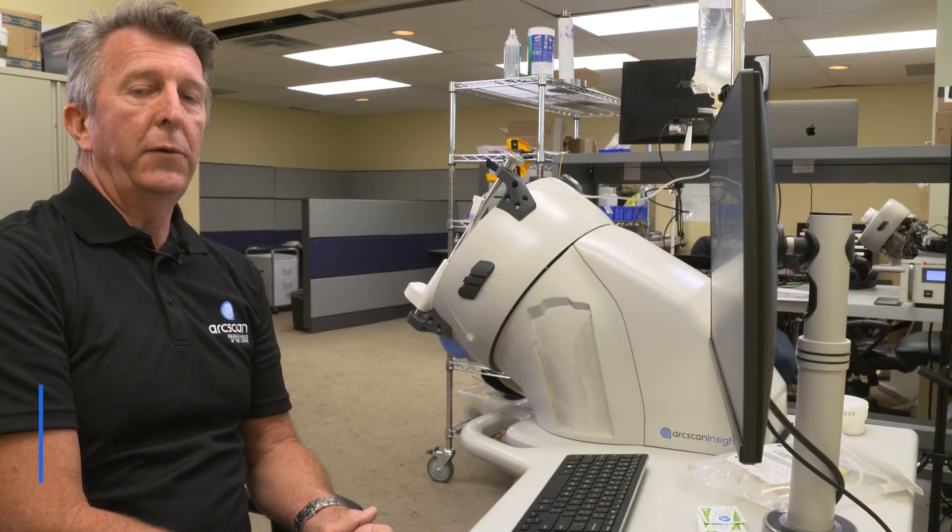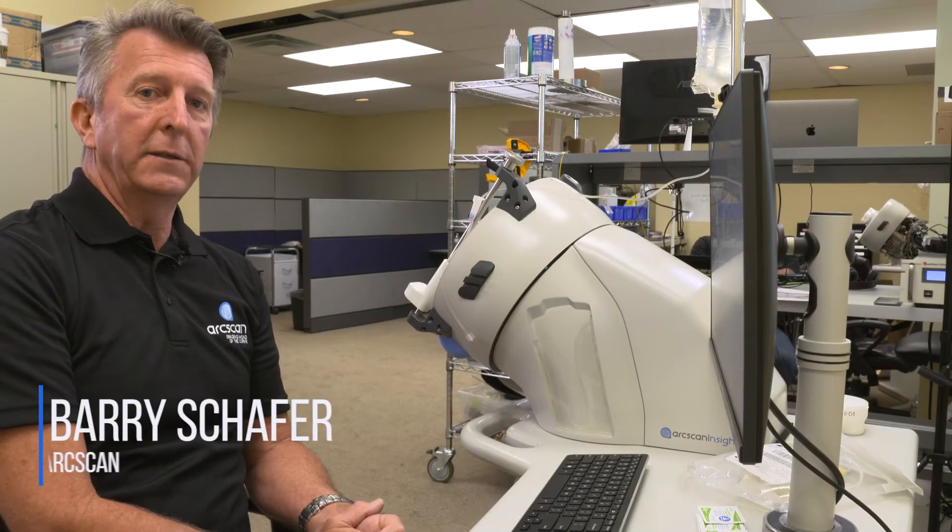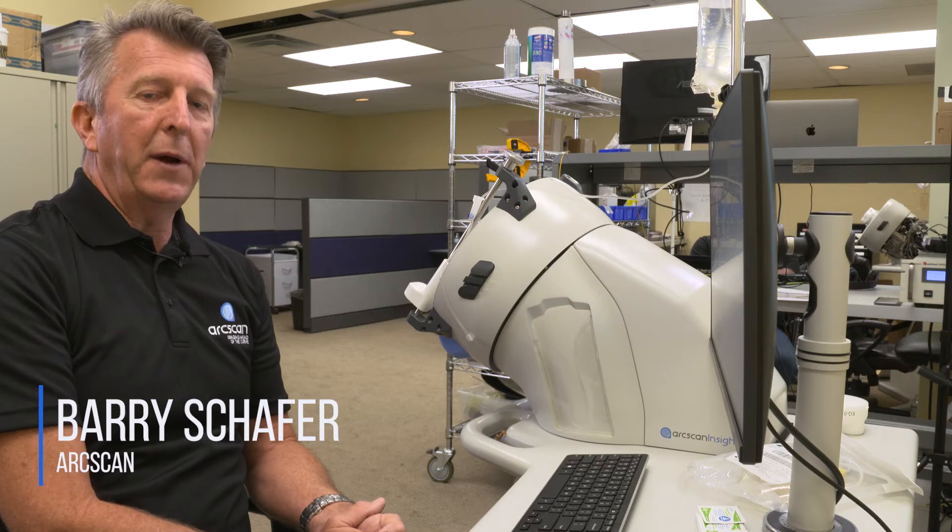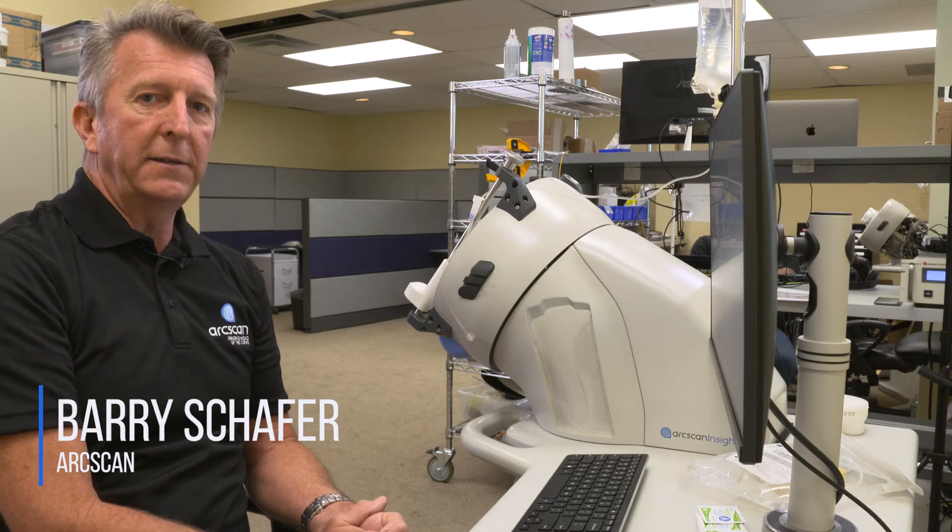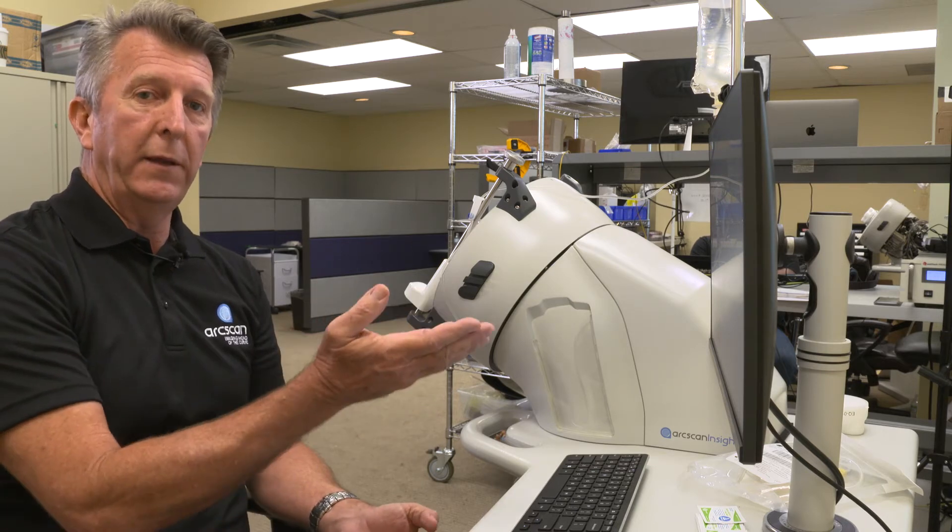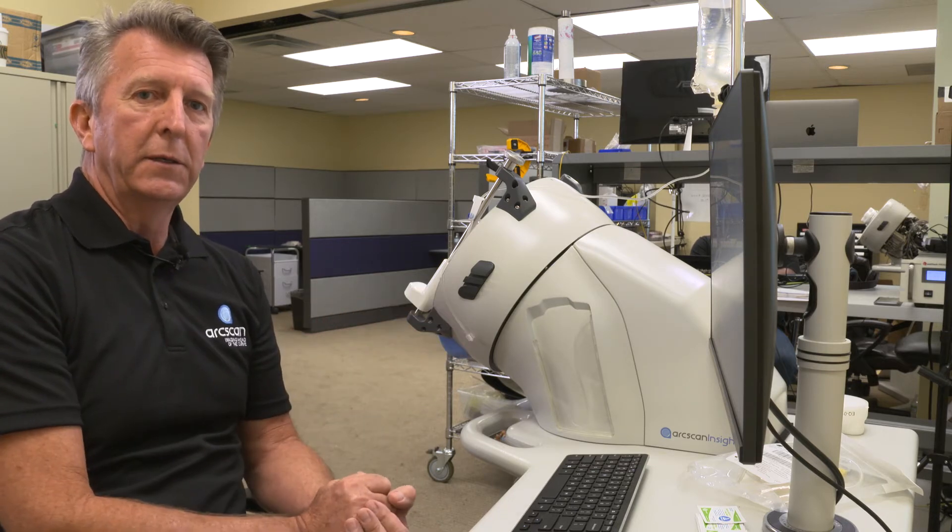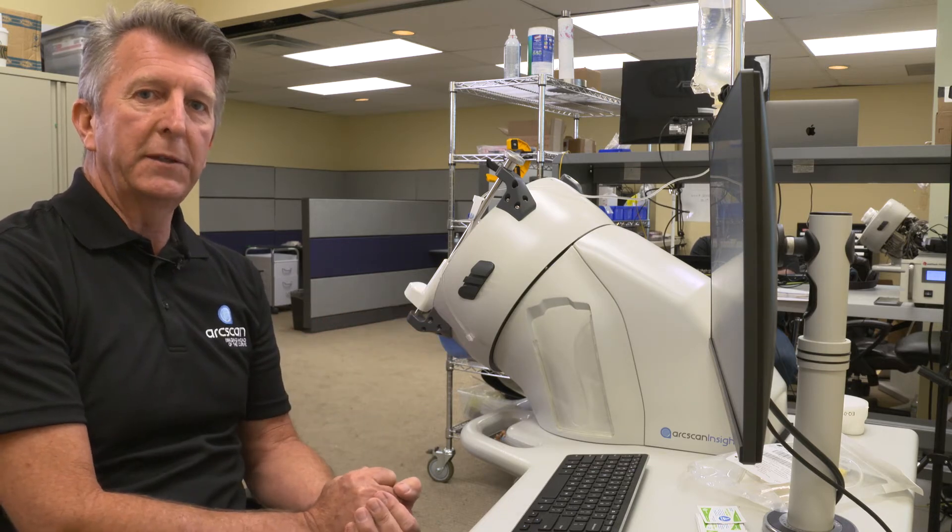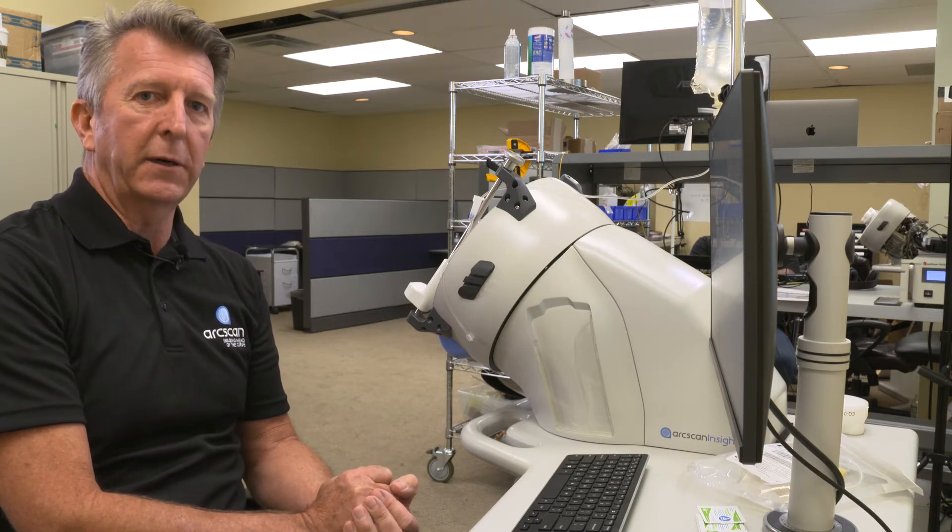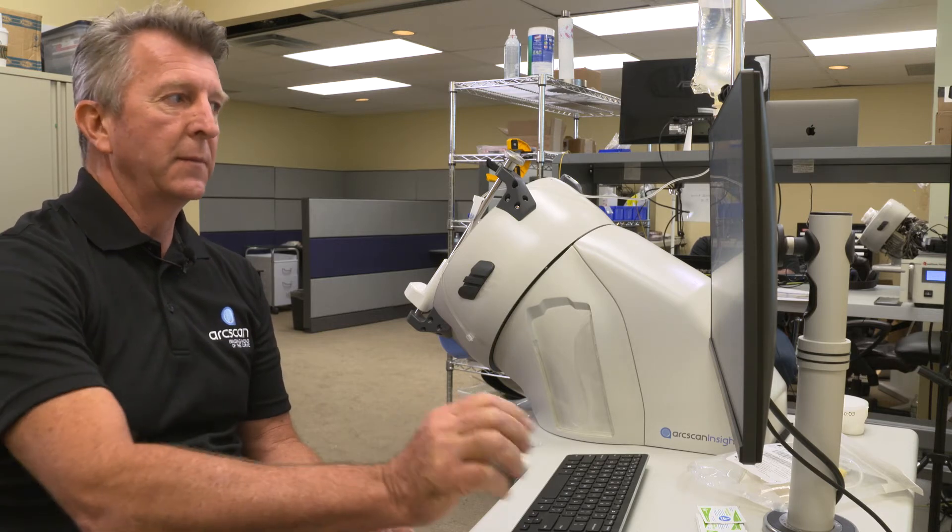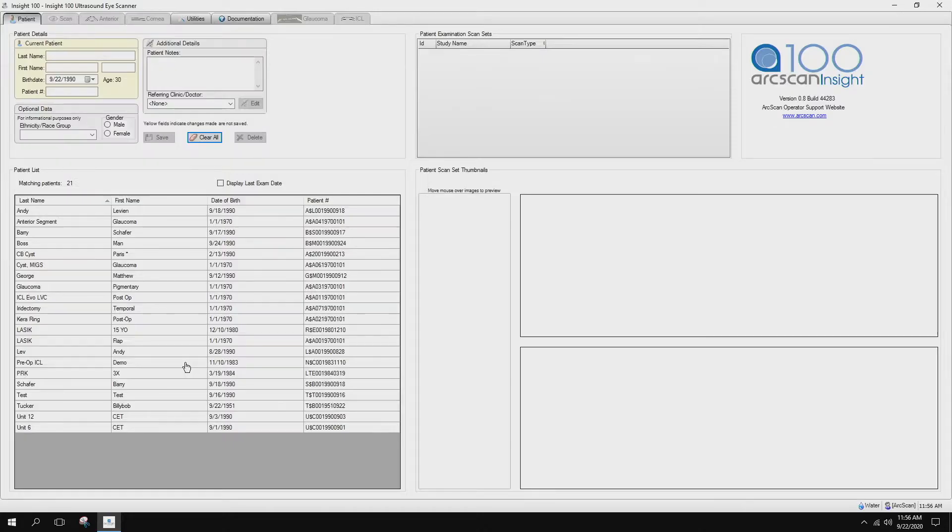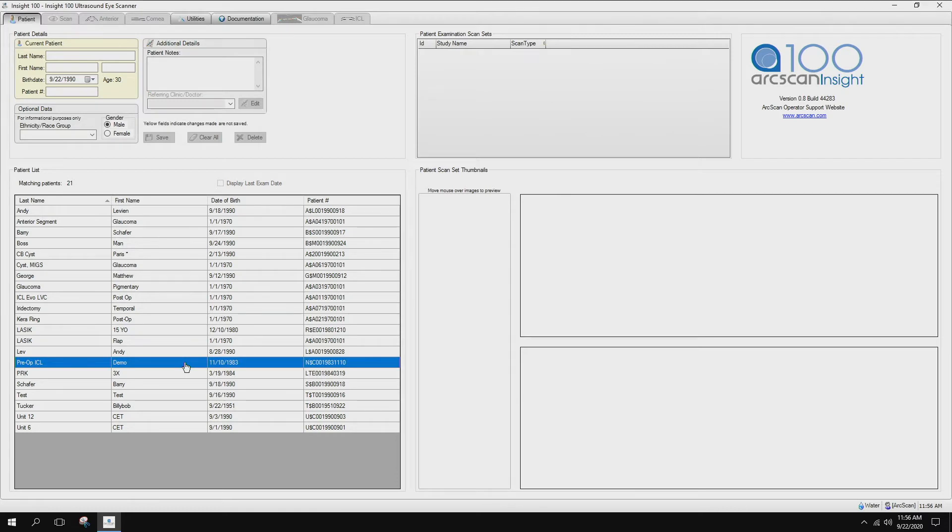I'd like to walk through the Insight 100 pre-op ICL sizing and the tools that we have within the instrument to place calipers and take measurements once the images are captured. Here we have a patient that we've already grabbed an image of.